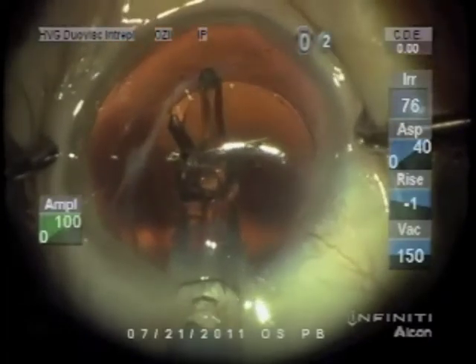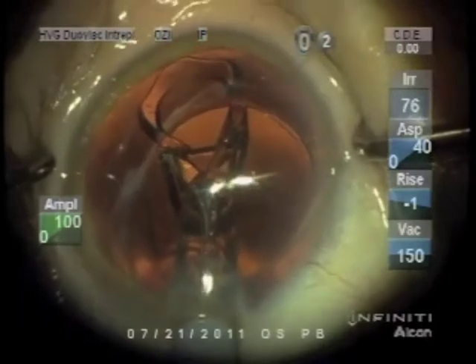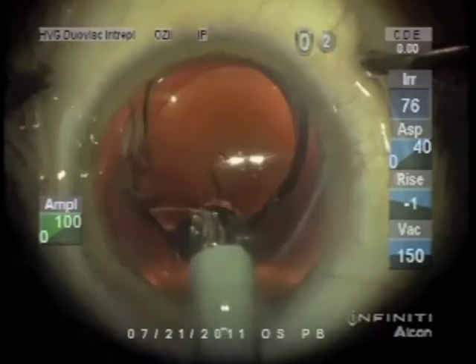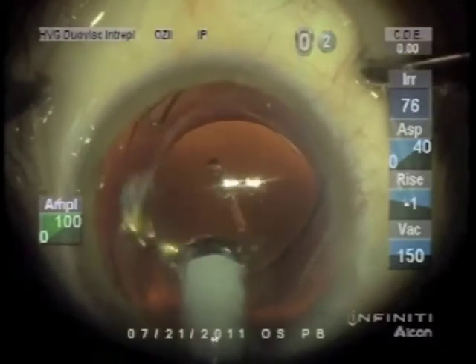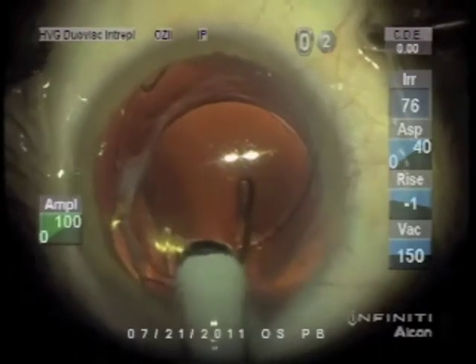These Sulcoflex lenses, made by Rayner Corporation in England, have been working very well for us for the purpose of sphere, cylinder, or sphere-cylinder additional correction.